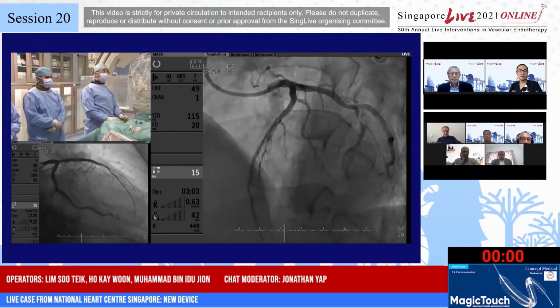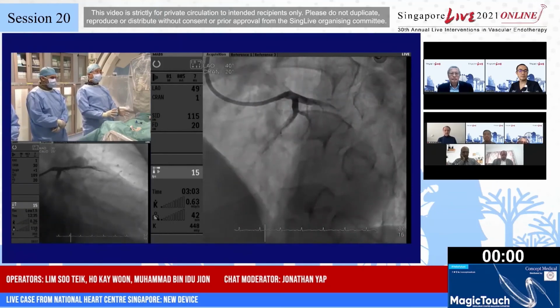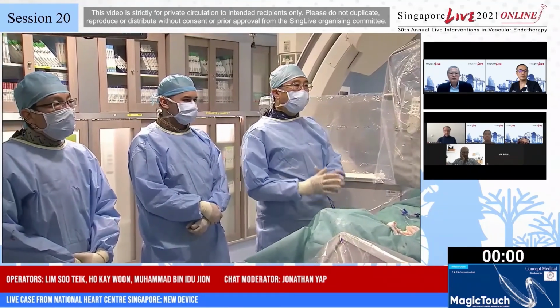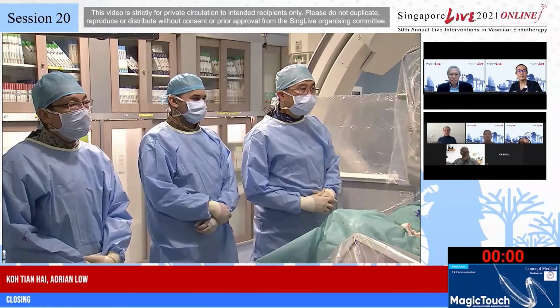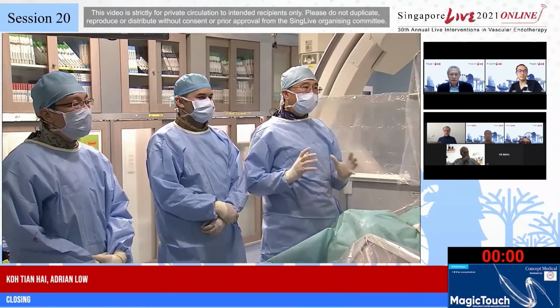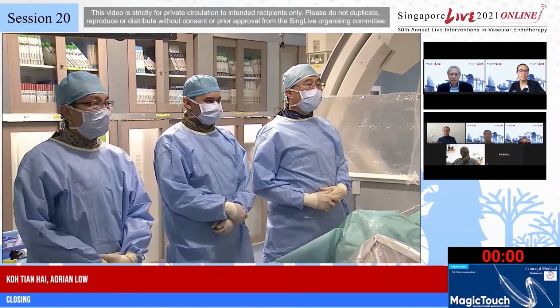Perhaps we can treat this more like a metallic DES at the acute phase, and hopefully the benefit for a longer term can be realized. So the 2 years data that Dr. Antonio Colombo presented is of great interest, and a bigger data series will be very helpful.